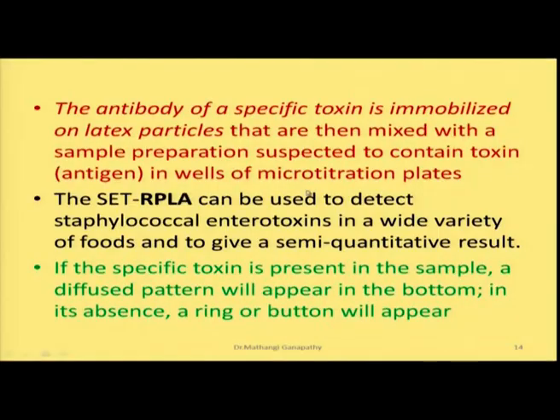The set RPLA can be used to detect Staphylococcus enterotoxins in a wide variety of food and to give a semi-quantitative result. So, if the specific toxin is present in the sample, you will see a diffused pattern in the bottom of the microtitration plate. In its absence, you will see a ring-like structure or button which can be visualized.